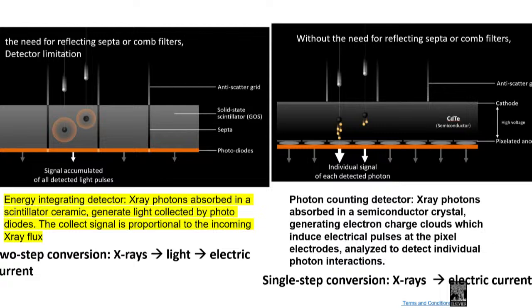You can make this only as thin as about 0.4 millimeter, which is the thinnest they have made. Think about it, a material that's as thin as 0.4 millimeter, which is pretty good already. So basically, the photon interacts with this solid state scintillator detector, and then converts the light into an electrical signal, okay?